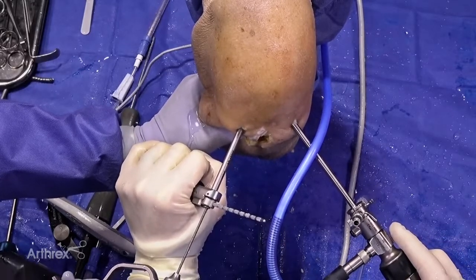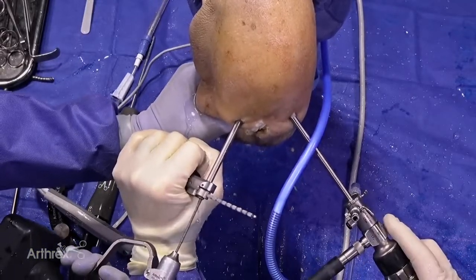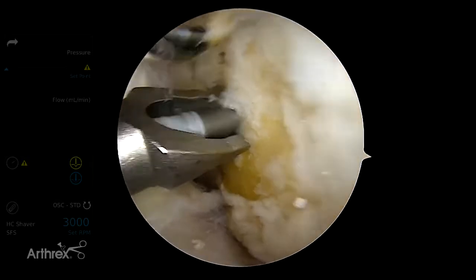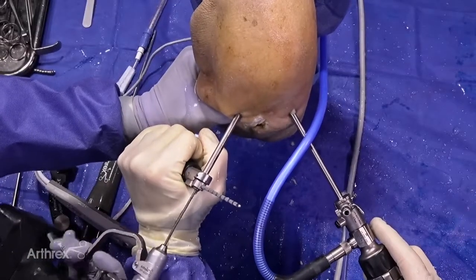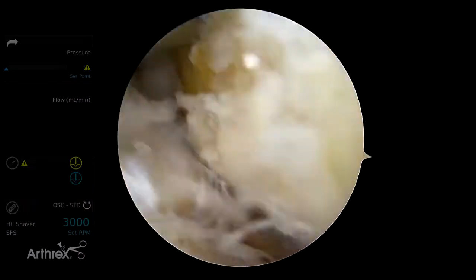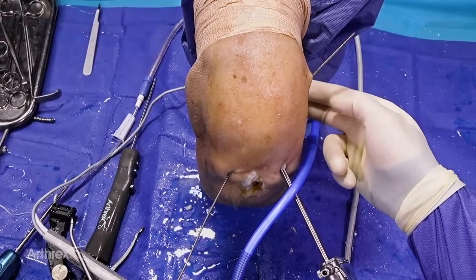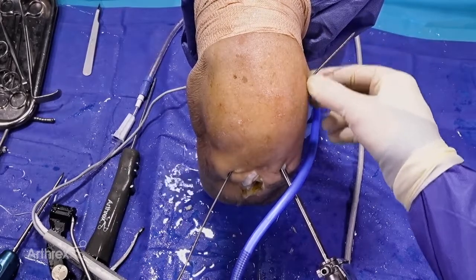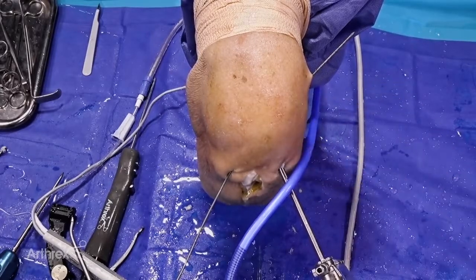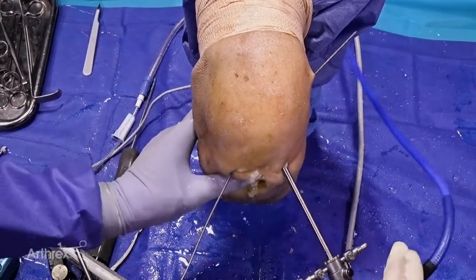With the knee in slight hyperflexion, bringing my hand down against the tibia, we can advance the wire. This wire is extremely sharp and in an ideal scenario it will come out right at the midpoint of the iliotibial band, as you see here. This is the optimal position — midpoint between the anterior and posterior femur with the wire coming out exactly in the middle of the IT band. If it comes out too posterior, simply drop and rotate your hand slightly vertically to achieve the perfect 45 degree angle position.